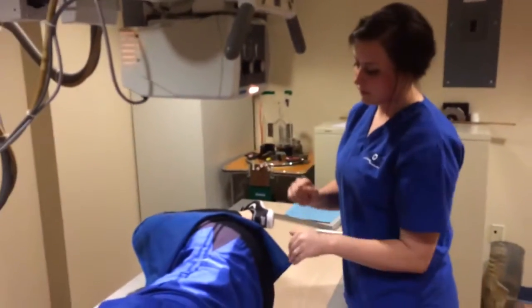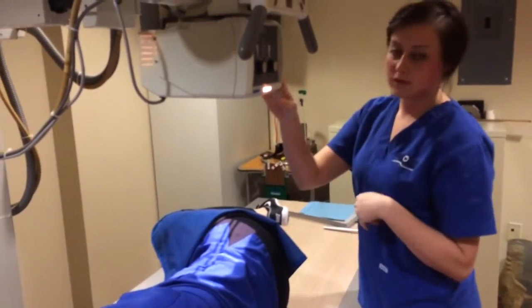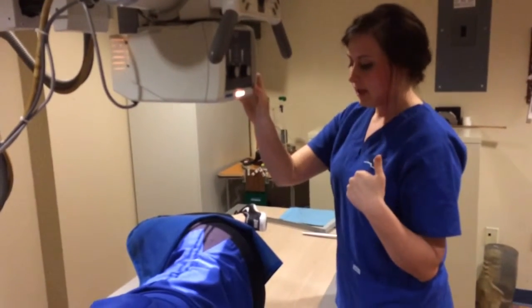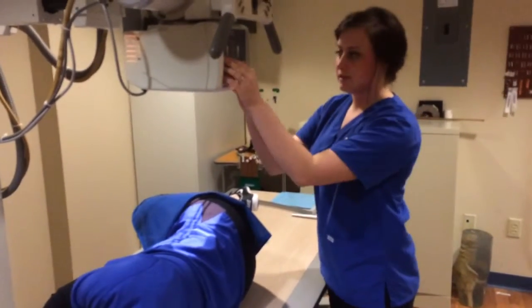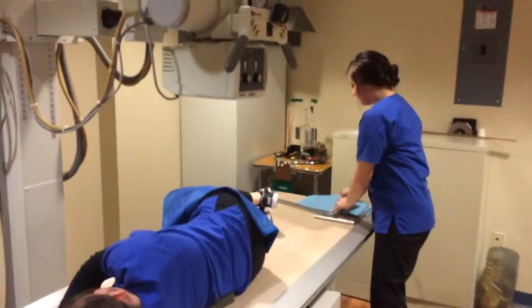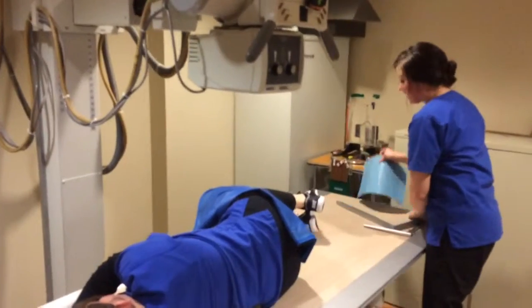Just a tad. And then after that, I'm going to have my collimation open to the full 17 inches, and I'm going to collimate down to about 7 to 8 inches crosswise. Next, I'm going to take some lead matting to put behind my patient.